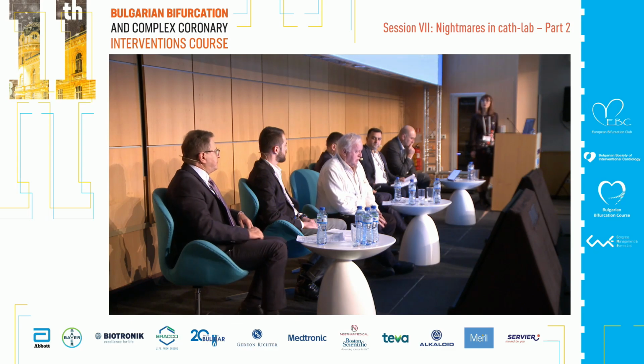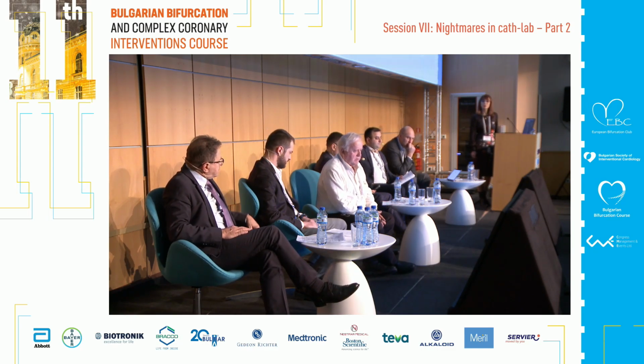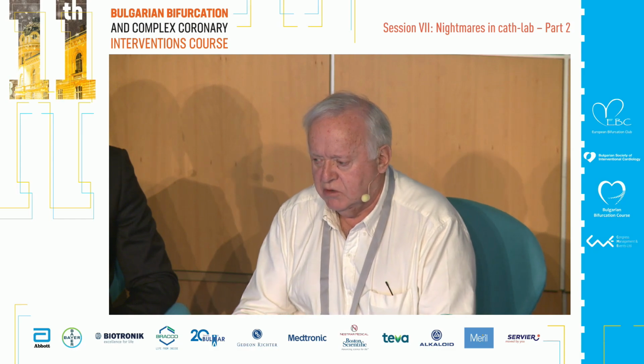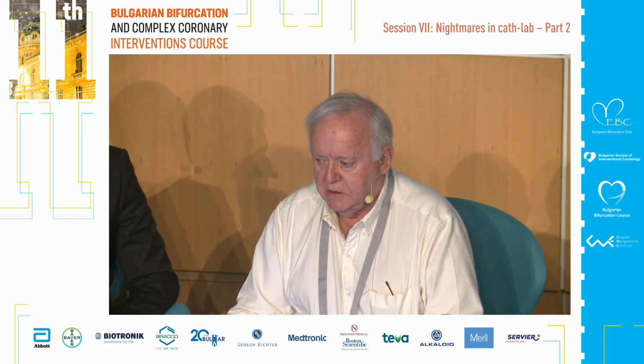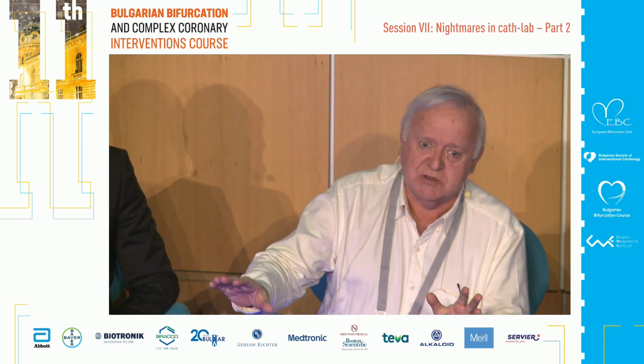Yeah, so what we do in Massy is that when we have a very proximal severe lesion, we treat before the TAVI, only the severe lesion. For this kind of patients, old, of course they want to live, but they are not playing football. So leaving some distal lesion is not a problem. We may have to retreat a lesion, but this is rare and this is not easy, as was shown.